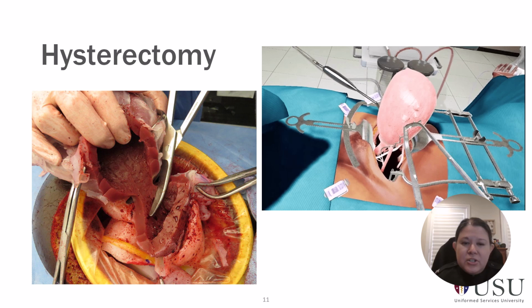I will say the tissue feel is a little bit different since it's silicone. It's a little firmer than what you would normally have for human or cadaveric tissue, but it's certainly a good option to test the process. And it allows you to really go through every step of the simulation, getting all your instruments, making sure your tray is open and counted. So that's a good option as well.